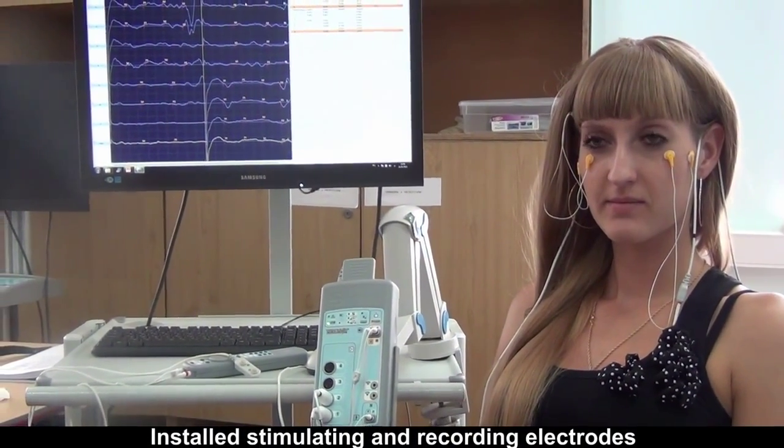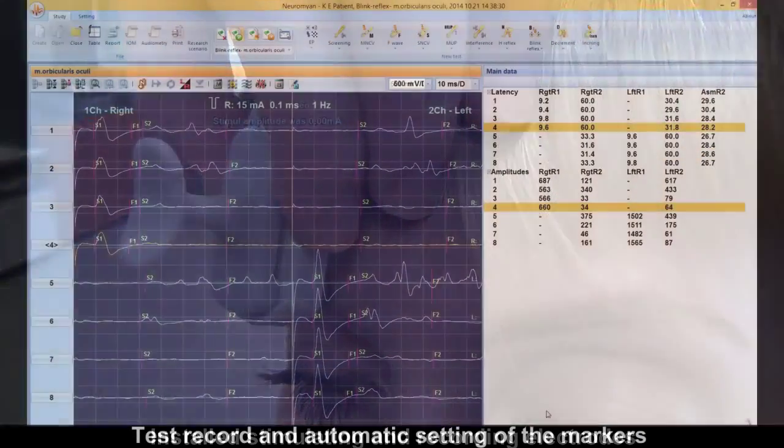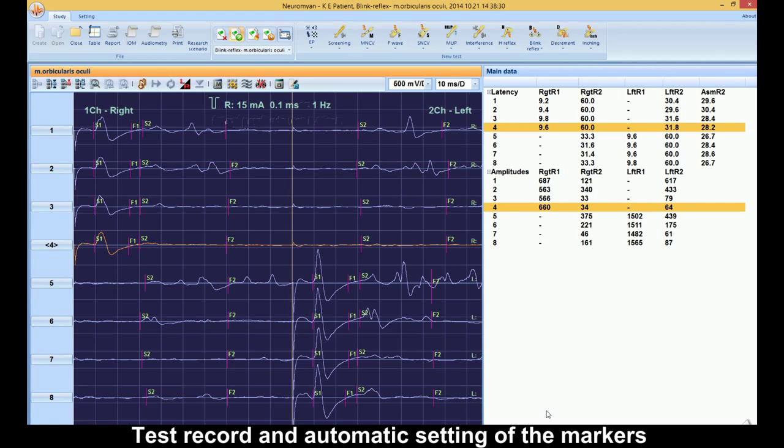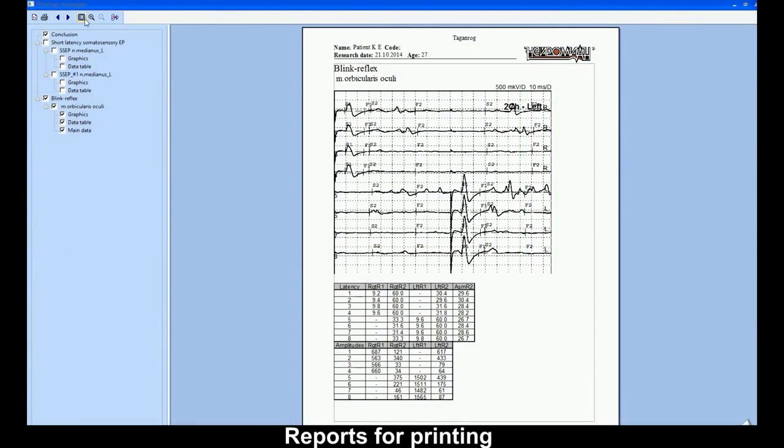of the eye muscle arising from stimulation of the first branch of the trigeminal nerve, recommended for the diagnosis of facial nerve neuropathy, test recording, automatic settings of the markers, and filling of the automatically generated table of calculated parameters.